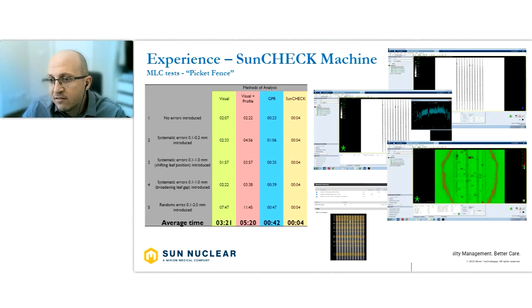So we can see here that we save a lot of time when we use SunCHECK for just one single test. We should remember that this test is important to do weekly. We plan to do it in a more robust way, blindly, with other colleagues analyzing, to test the sensitivity of the analysis, comparing this method.